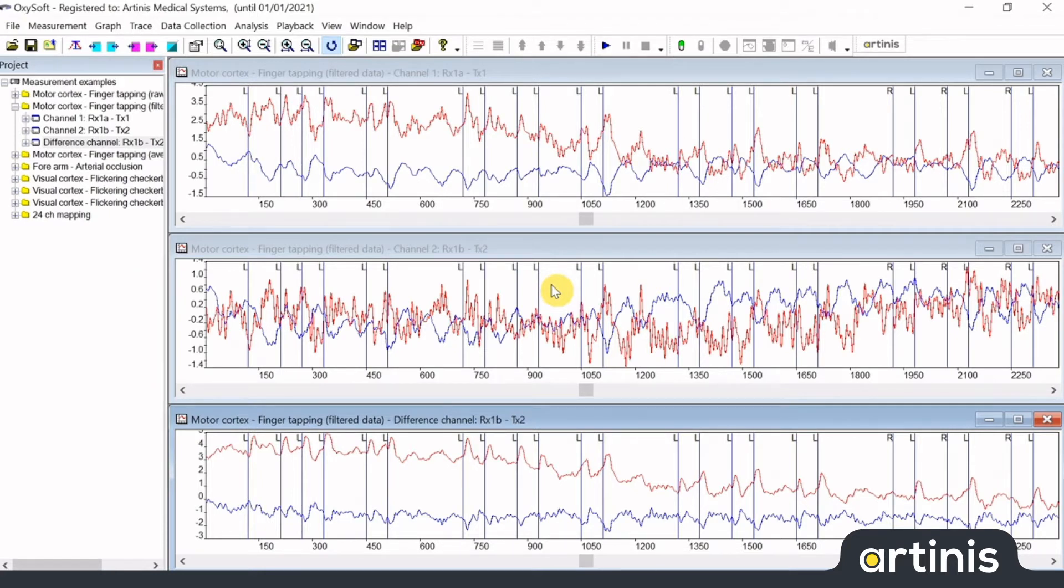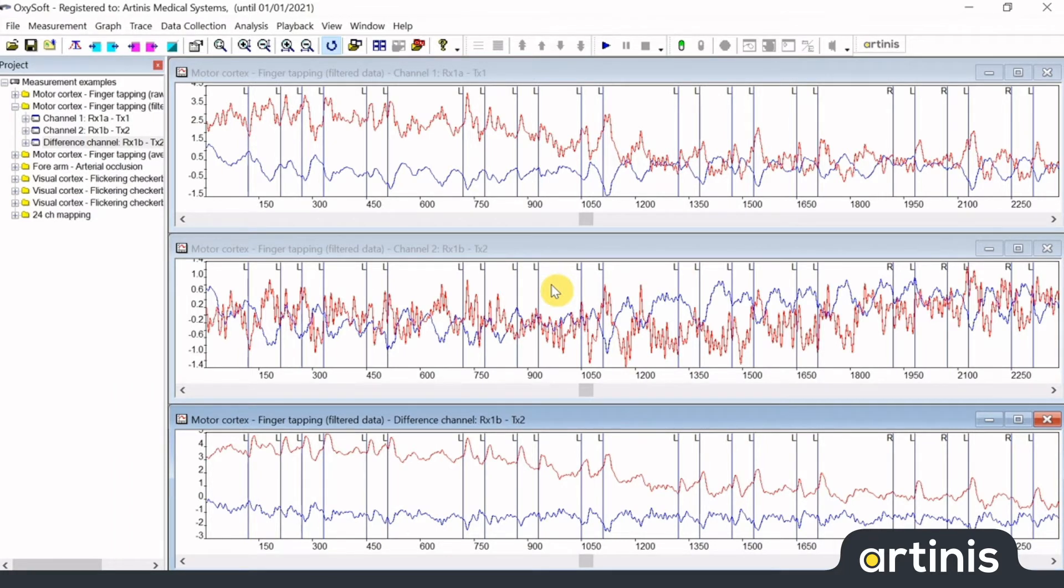You can place events in Oxisoft during a recording, but also afterwards. Events are used to indicate a timestamp during the measurement, for example to mark start and end of a task, or mark a possible disturbance of your measurement.